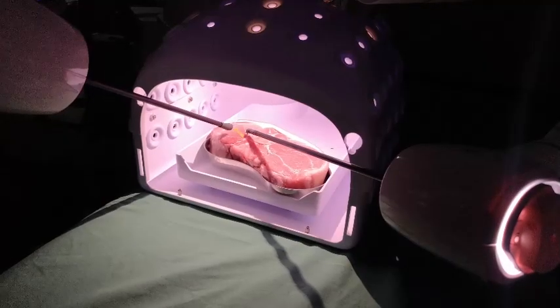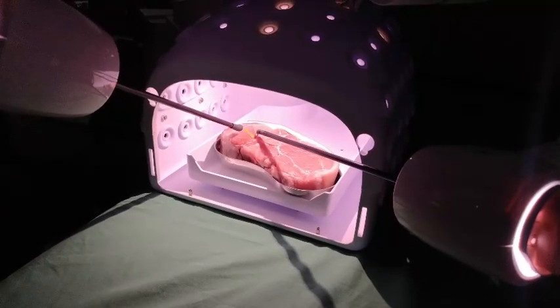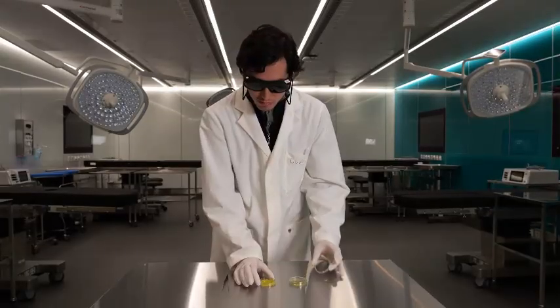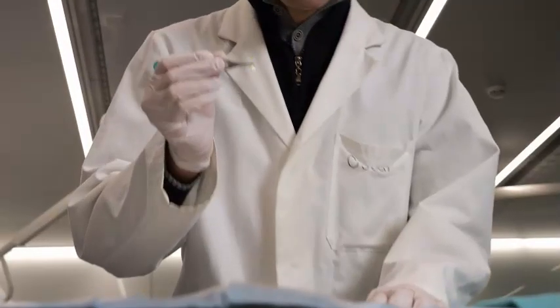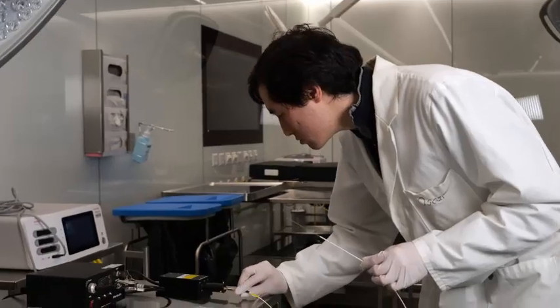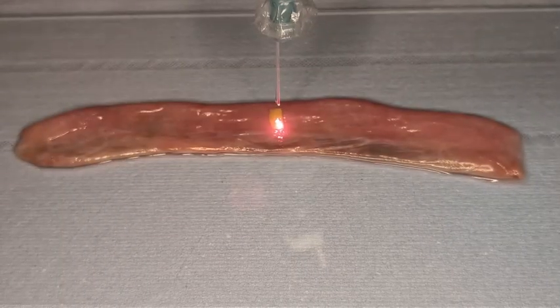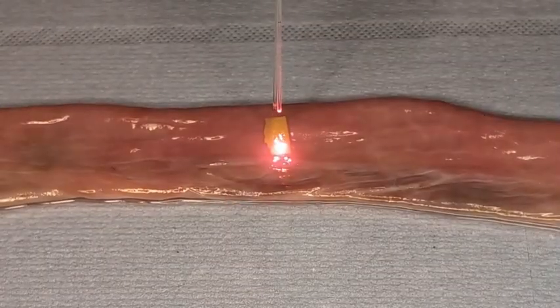This is why we have introduced a robotic platform to perform laser tissue soldering. With laser tissue soldering, we can use a laser to close wounds. We first place a solder paste, which is protein-based, on top of the wound, and then we use the laser to increase the temperature, which gently fuses together the tissue and the solder paste, creating a nice seamless bond throughout the whole wound.